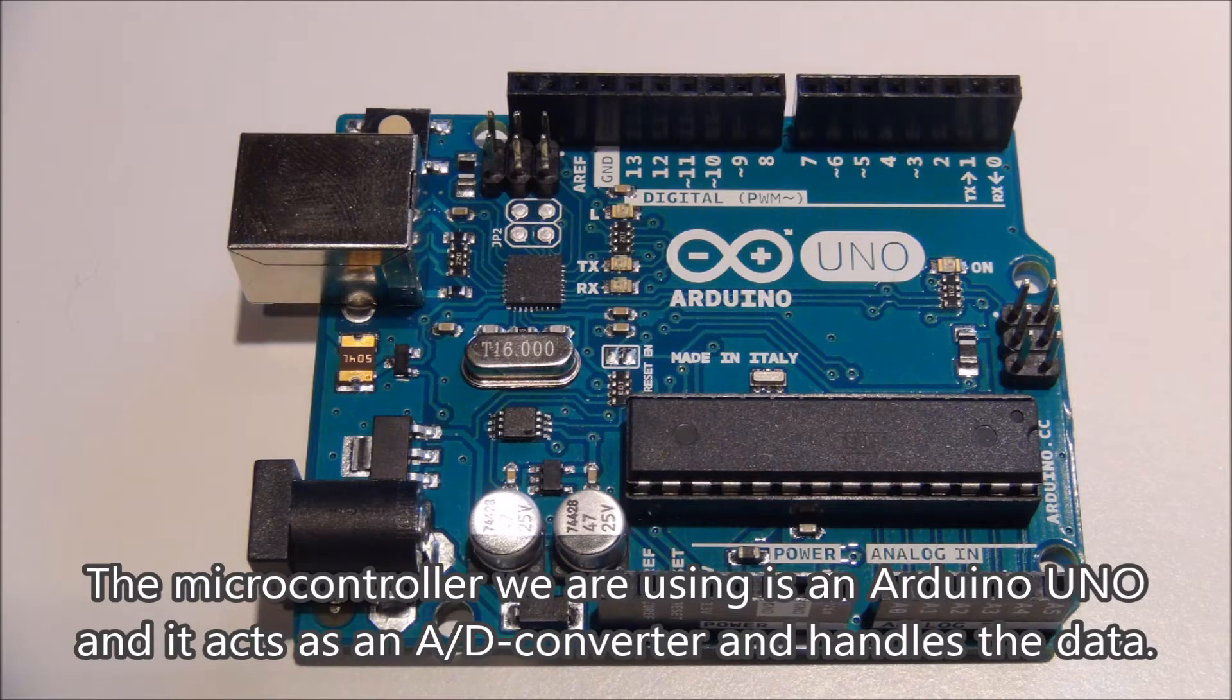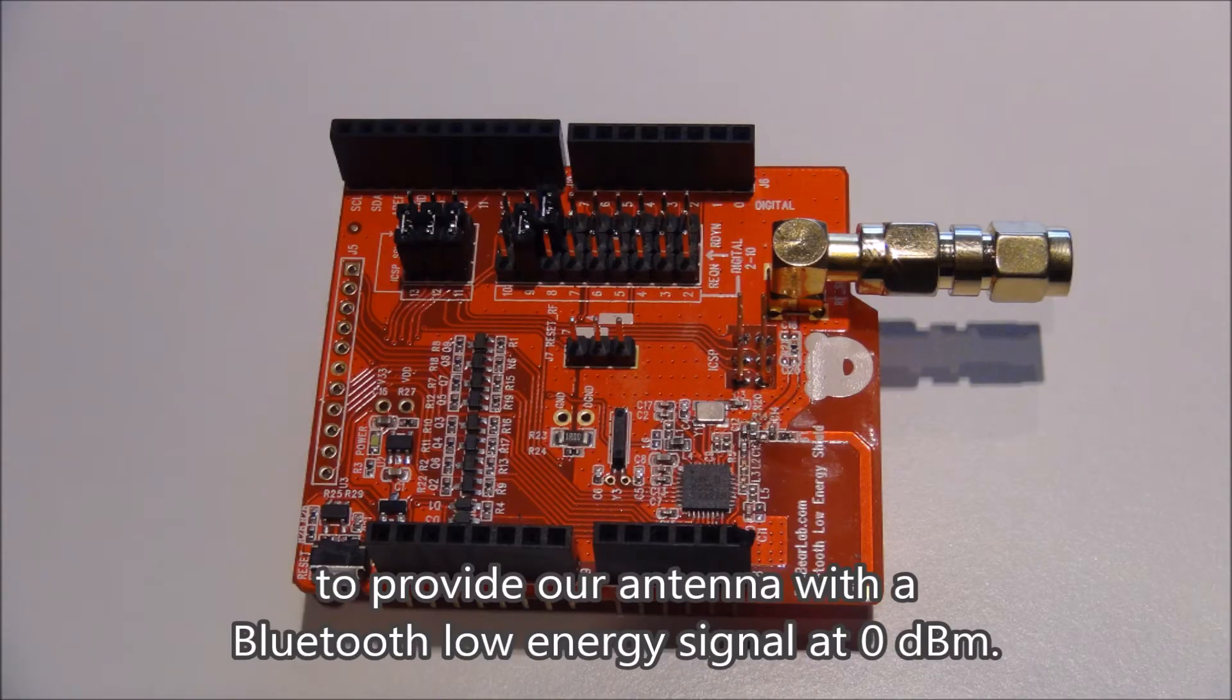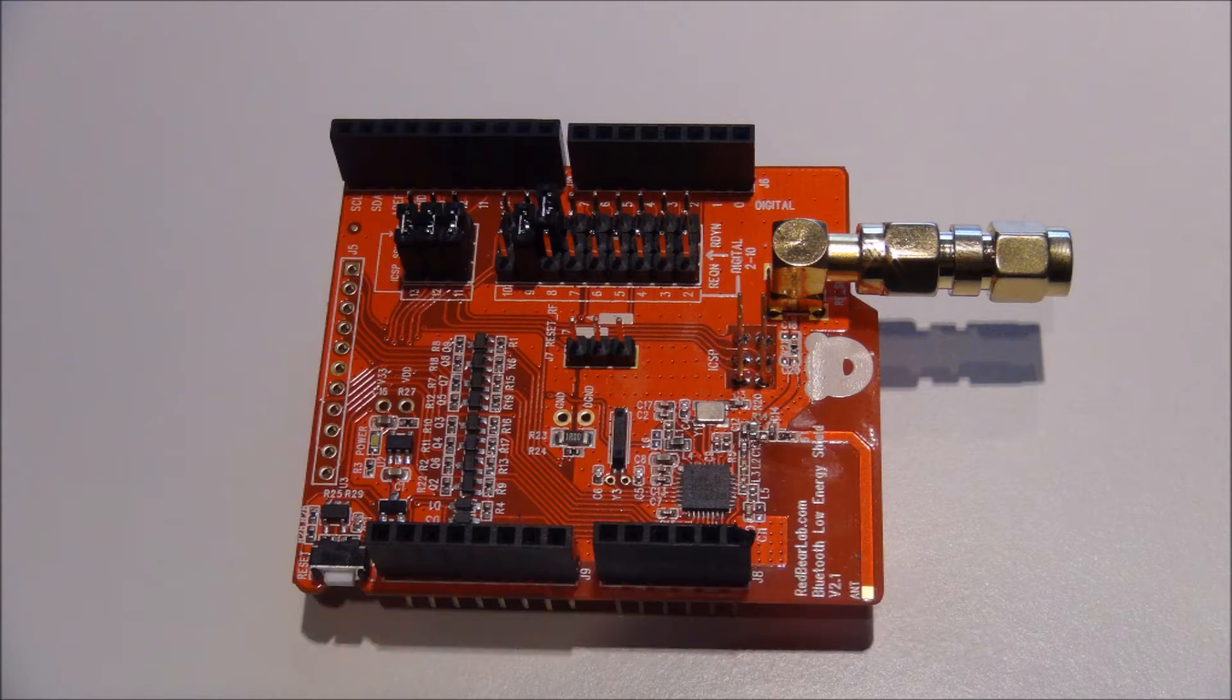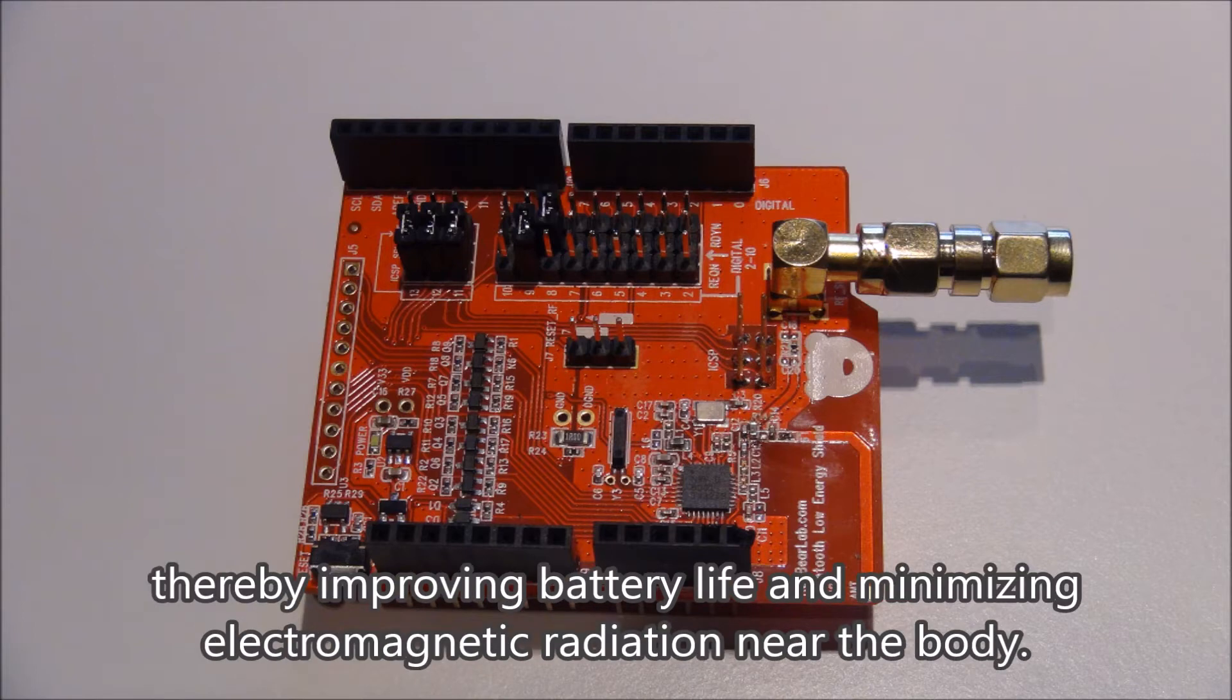The microcontroller we are using is an Arduino UNO, and it acts as an AD converter and handles the data. The data is transmitted through the transceiver shield to provide our antenna with a Bluetooth low energy signal at zero decibel milliwatts. Bluetooth low energy was chosen because of its low energy consumption, thereby improving battery life and minimizing electromagnetic radiation near the body.